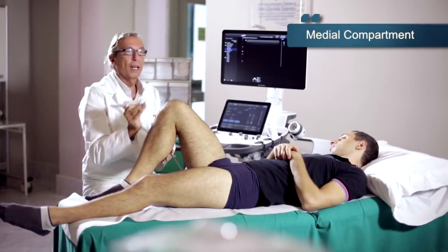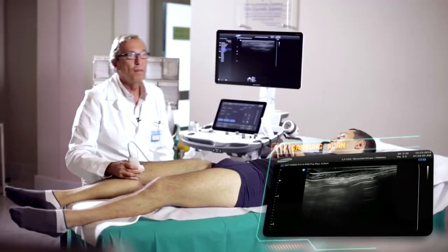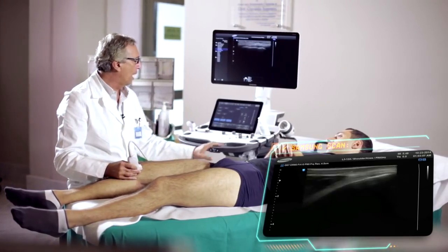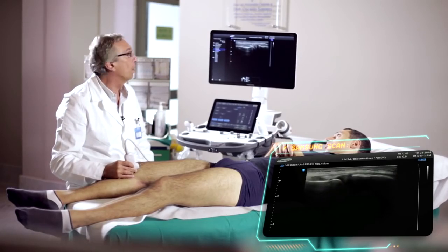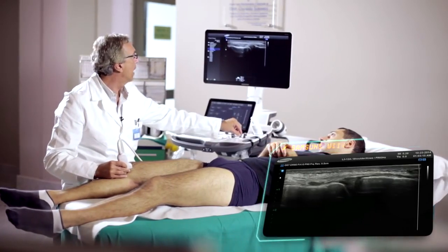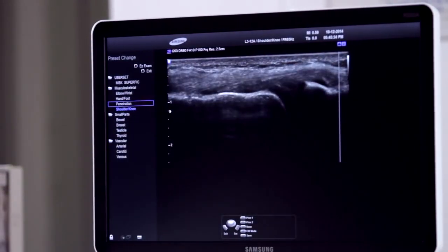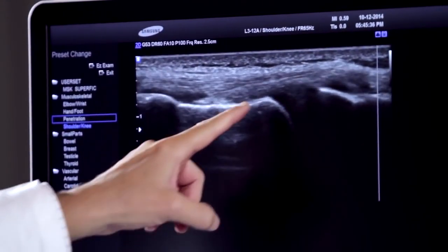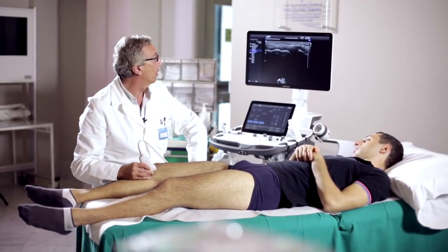After this, we evaluate the anatomical components of the medial compartment of the knee. We will try to analyze one of the most important, which is the medial collateral ligament. As you know, this ligament has a peculiar morphology and anatomy, and it is made by two components. A surface component, which we can see in the image, and this is characterized by a ribbon-like structure that covers the medial compartment, and a deeper component, meniscofemoral and meniscotibial, which accounts for the complexity of this ligament.